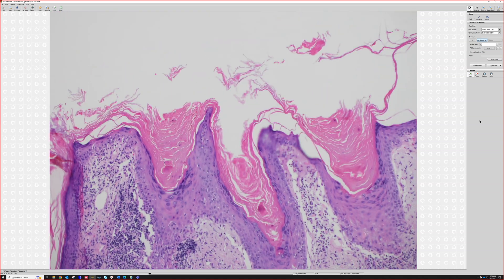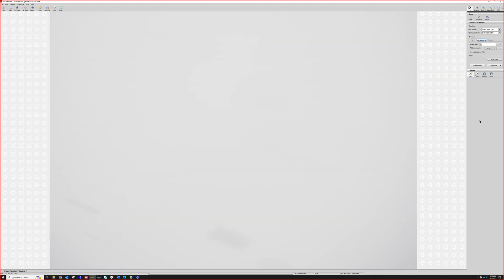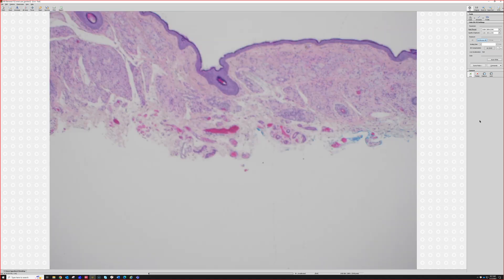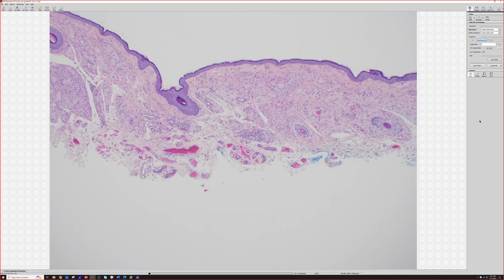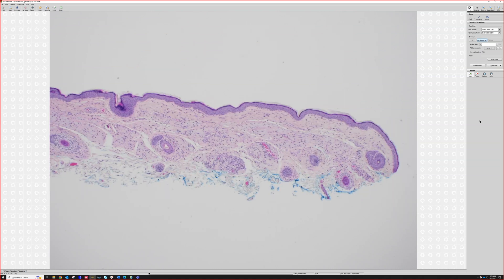And then there are the dilated follicles plugged with keratin — a great classic finding for discoid lupus. Of course, this all has to fit clinically as well. Some people find CD123 helpful, as it highlights clusters of plasmacytoid dendritic cells in many cases of lupus. It can be a challenging stain to interpret, but for test purposes, know that CD123 clusters favor lupus erythematosus in general — not just discoid lupus.